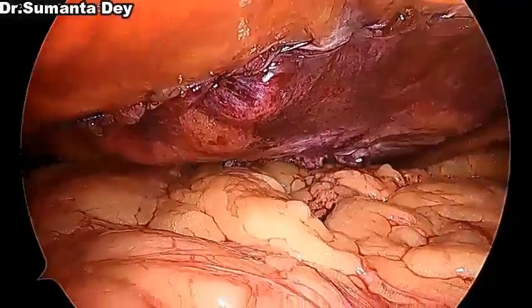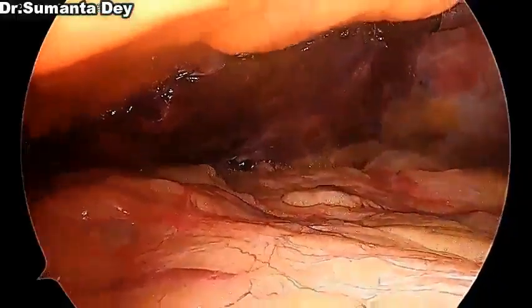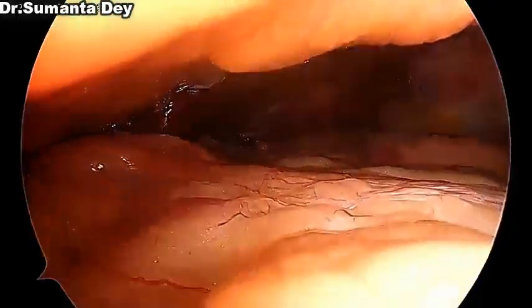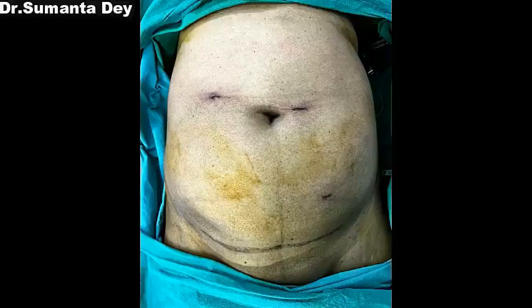The patient came for a visit. There is no seroma, and that's it. This is my preferred approach for lateral hernias. And this is the postoperative picture. You can see the three ports, and the TAH scar is visible. There is apparently no bulge on the right side now.